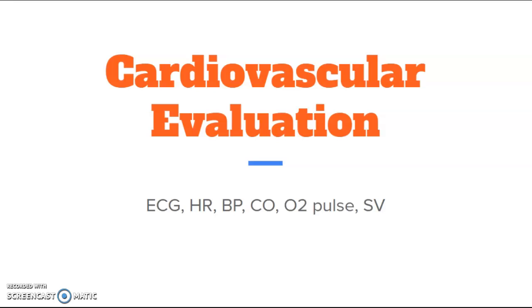Cardiovascular evaluation with exercise testing. The items you want to take a look at are your ECG, heart rate, BP, cardiac output, O2 pulse, and stroke volume.